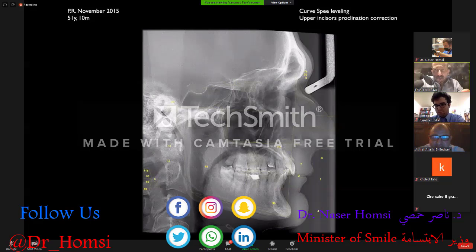Yes, we do. He asked, would you recommend using mini screw as an alternative to transpalatal arch? Yes, it can be considered an option.